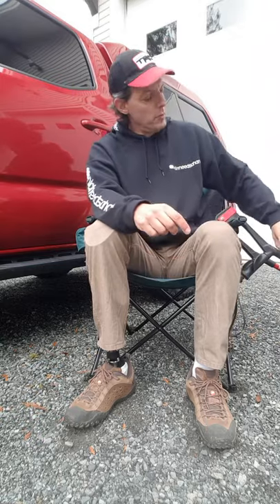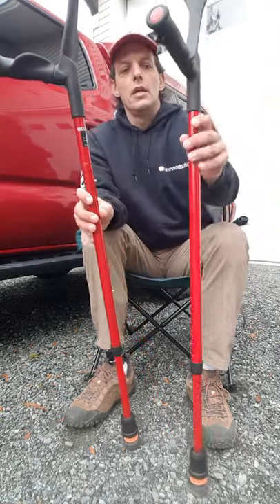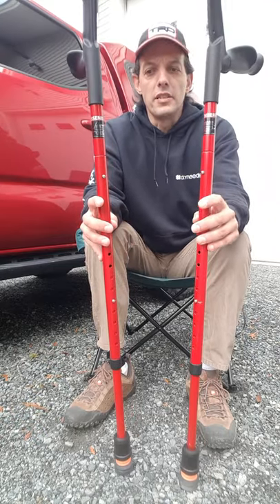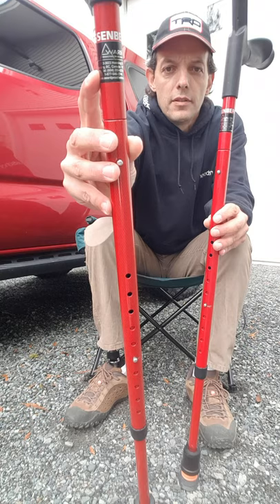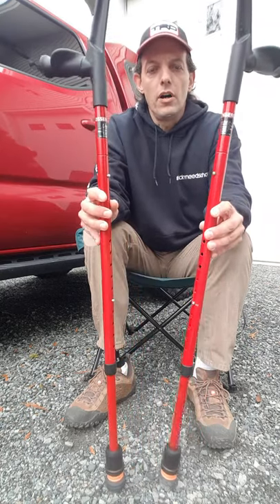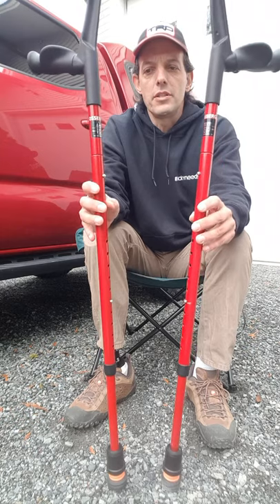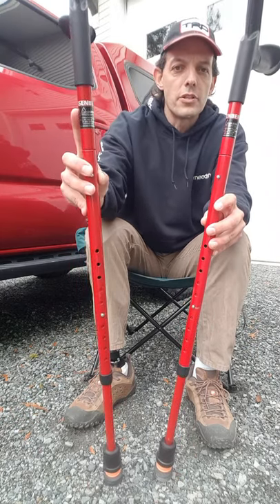Good morning everybody, today is October 17th, 2020. In this video I'm going to be talking about my new crutches. These are from my prosthetist, Award Prosthetics in Burnaby, BC, Canada. They have a huge selection of all sorts of styles and brands of crutches, my personal favorite being the Ossenberg crutch out of Germany.